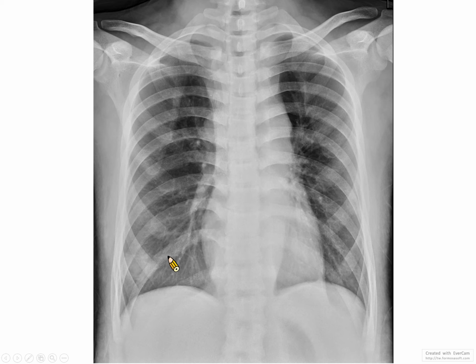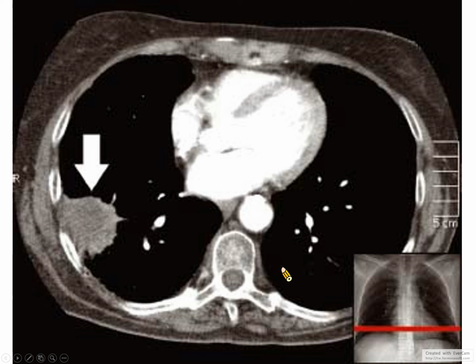I would say that a very experienced radiologist can see these things, but if you are a medical student, or a doctor that does not have a specialty in radiology, then we have a very high chance of missing this tumor. But anyway, based on the CT images we find this tumor, and the next thing is that we need to know whether this tumor is benign or cancerous.